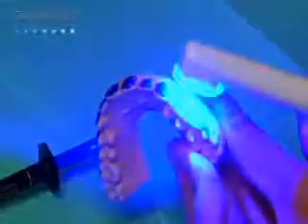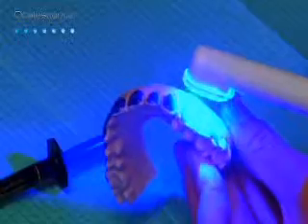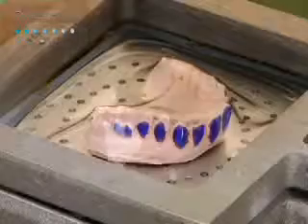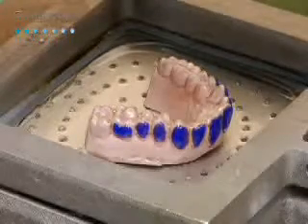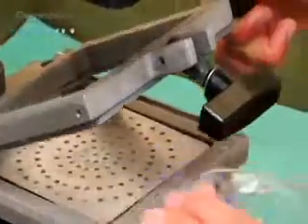Cure LC blockout resin for approximately 10 seconds per tooth with a handheld intraoral light. Wipe off the oxygen inhibition layer. With a vacuum former, heat the tray material until it sags approximately 1.5 inches. Activate the vacuum and adapt the softened plastic onto the model. Allow the tray material to cool and remove the model.